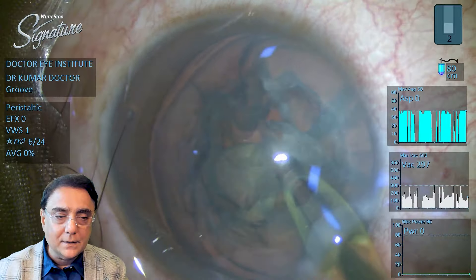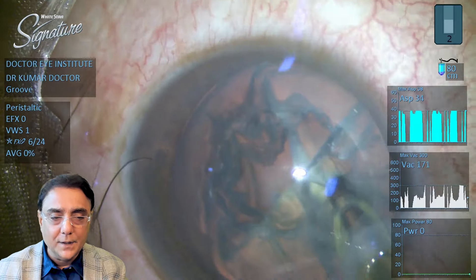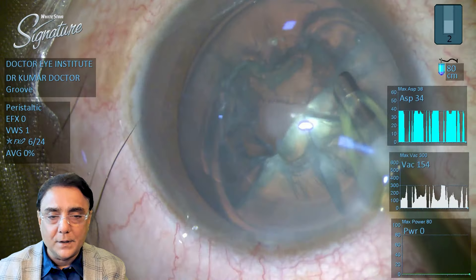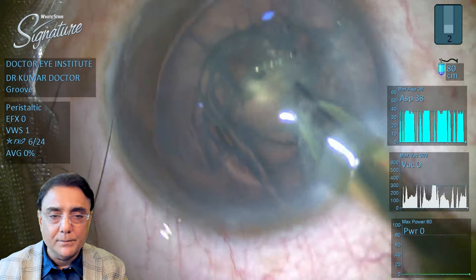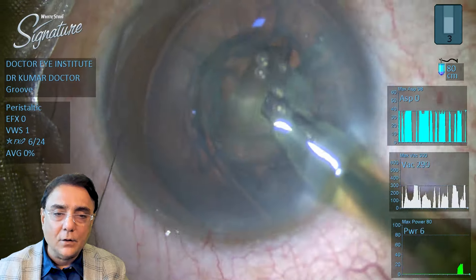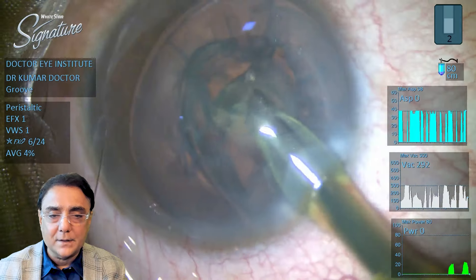You can see that the vacuum set is only at 300. There is hardly any power being used. On and off, you will see the aspiration depending on the occlusion at the tip. In the same way, the whole central nucleus — all six pieces — are being aspirated one by one.